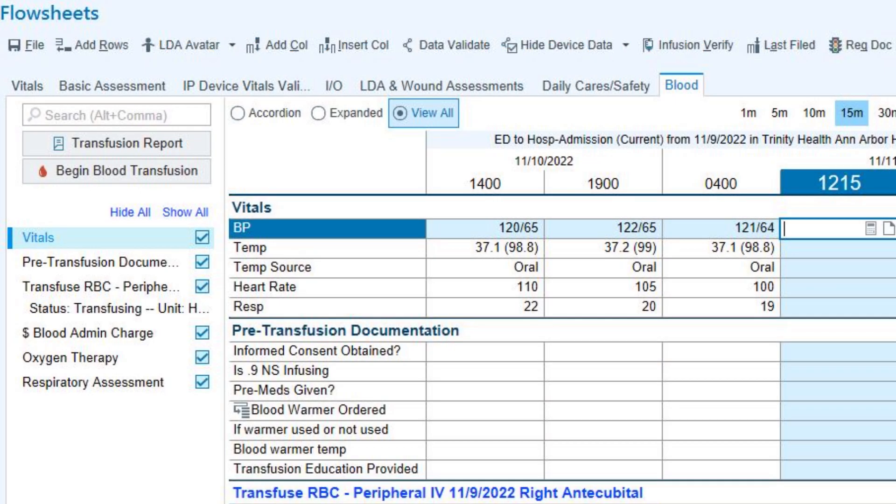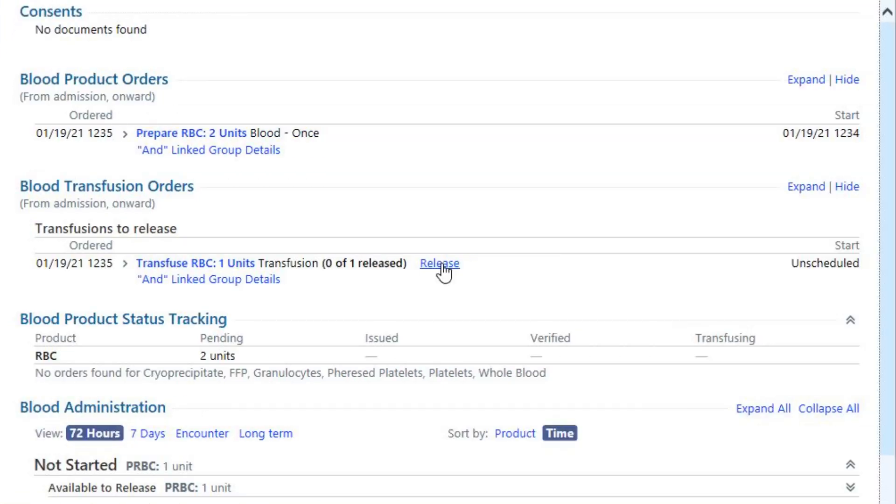You are now ready to release the blood product. Go to the blood tab in the flow sheets and click on Transfusion Report in the left column. A new window will open — click on the release hyperlink. This will prompt blood bank to send the blood to the floor.